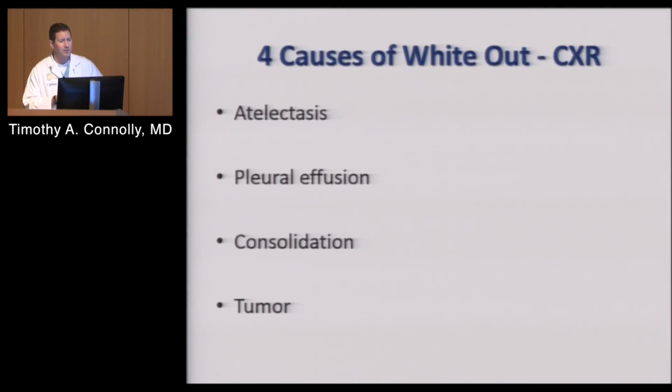I put this slide up because it's one of the first things I learned in medical school, and I thought it was brilliant because it really demystifies a lot of what we look at radiologically in terms of plain X-rays, because it's really hard. When you see people early on in their training, they'll see an abnormality on the film, and they'll try to start giving you diseases that might cause it or bugs that might cause it. You always want to break it back down to something more simple.